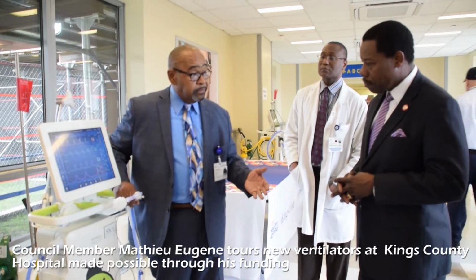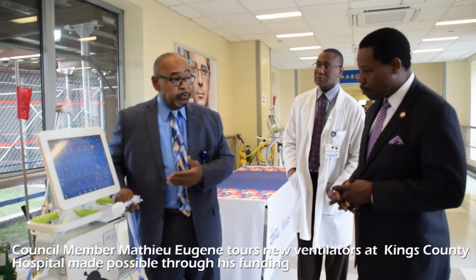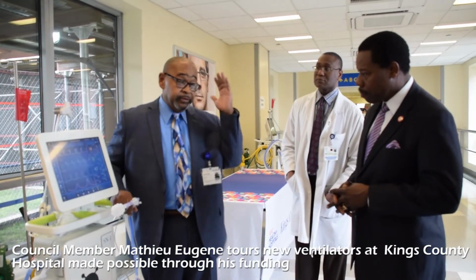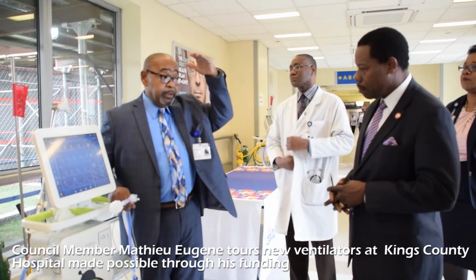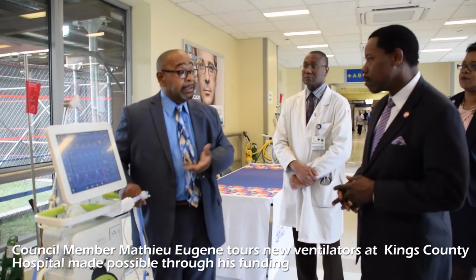The other thing it does is put the ventilator in sync with the baby. When the signal from the brain gets to the diaphragm, as I said before, the machine actually cycles into the breath. It also allows the baby to control the size of the breath. So if the baby's metabolic activity increases and they need a bigger breath, they're going to get it.